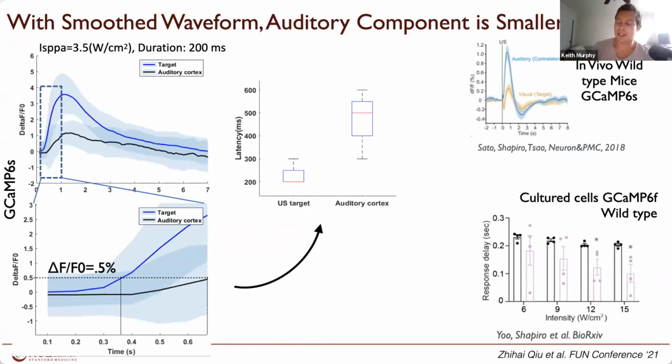Yeah, correct me if I'm wrong, Kim, but the more reflection against an interface that you have, the more radiation force you may have at that interface. So the more net displacement of the bone, right? Something like that, acting on the bone, yeah. So Kim said if you have a higher angle like that other paper had, you're going to get more radiation force, or pushing of the bone, and that may lead to shear waves that propagate out to the cochlea. So it all fits, and I really love your work, Kim. I think it's awesome, as you know, because I've seen it many times. Yeah, well, I have to thank Jorhai, who's done quite a bit of work here, so it's all his.